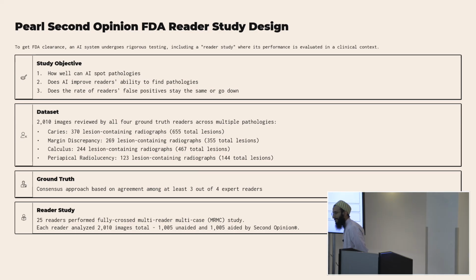Well, so you said you built this tool when you were doing the checking, and then they would go and say yes or no. Yeah. But that was just the one dentist. Did you ever try doing comparables between 2 dentists? Yeah, so for the clinical trial, yes. So I'll break things up a little bit. For the clinical trial, the way it was structured, 3 out of the 4 experts had to agree that this is a lesion. That's kind of where it ended.